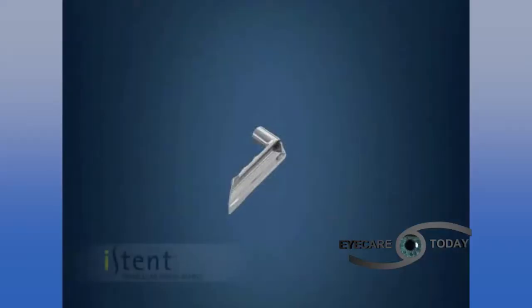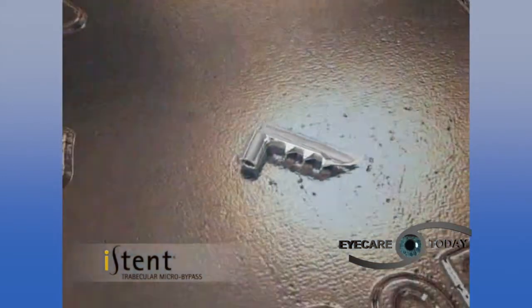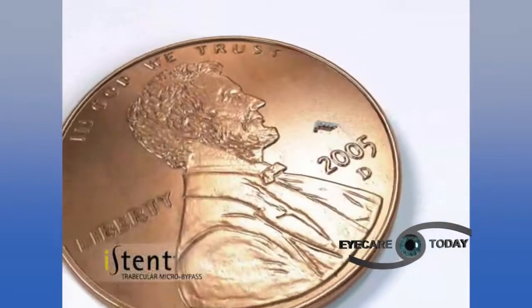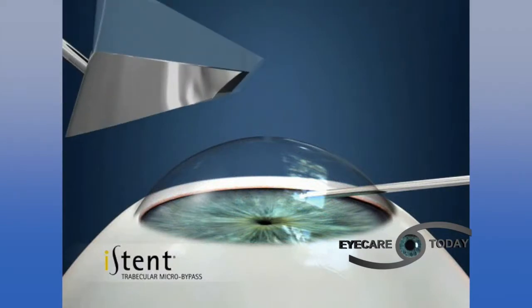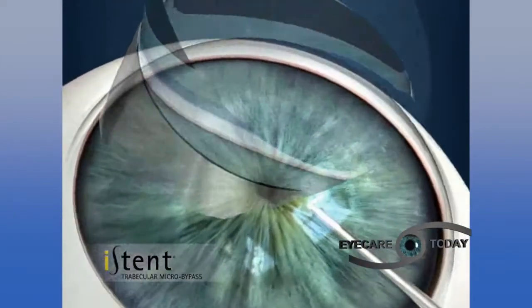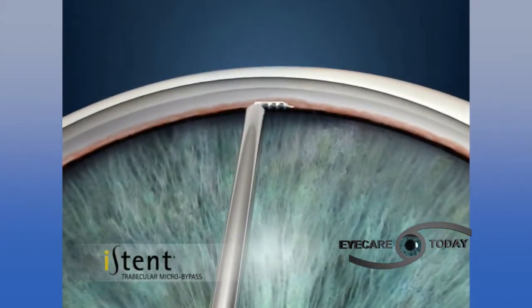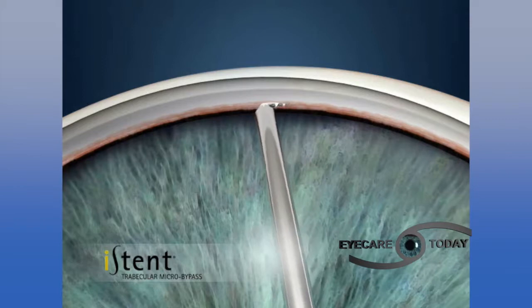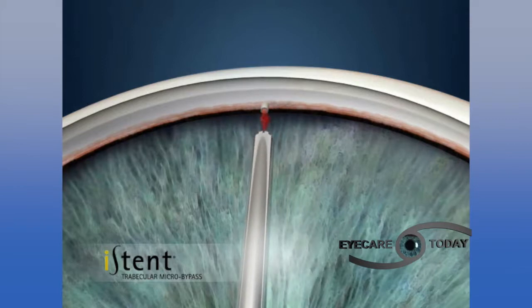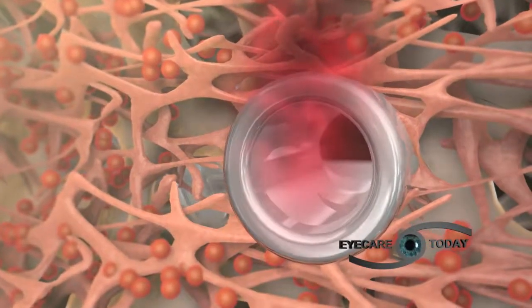Okay, great. So this first video, Dr. Bucci, walk us through what we're seeing here. Well, you see the stent, and now it's a great way to appreciate how small it is. You know, it's placed on top of a penny. Again, the smallest device ever approved. Now this is a special mirror that goes on top of the eye, which allows you to see what we call the angle of the eye, where the cornea meets the iris. And this is just showing in an animated way that little stent going into that meshwork, that drainage part of the eye, and it's going to allow the fluid to bypass, and the little blood that comes back lets you know that you have connected to that external area that you want to. You want that little blood to come back, and you're actually going to see that in the videos, because that lets you know that the stent is in the right place.